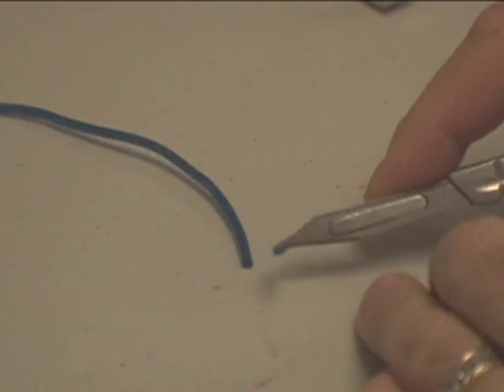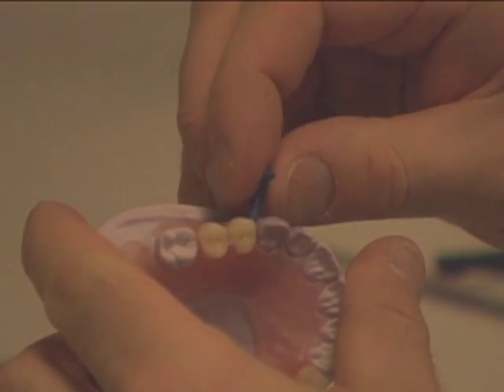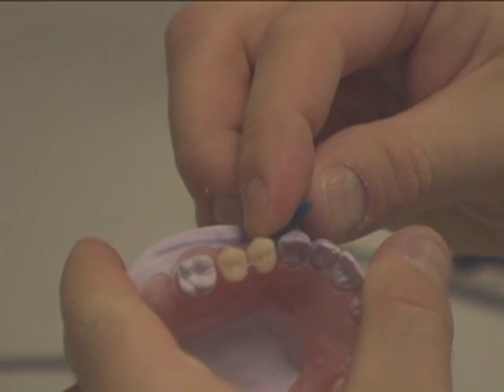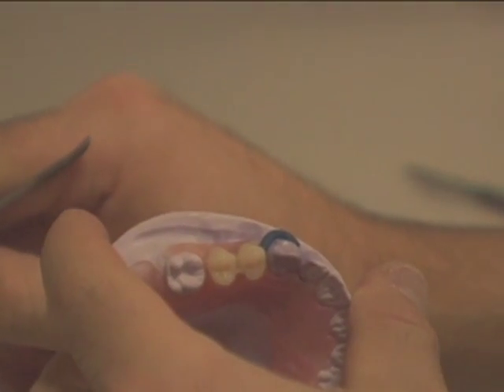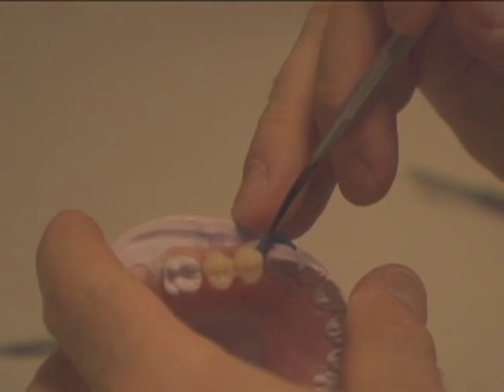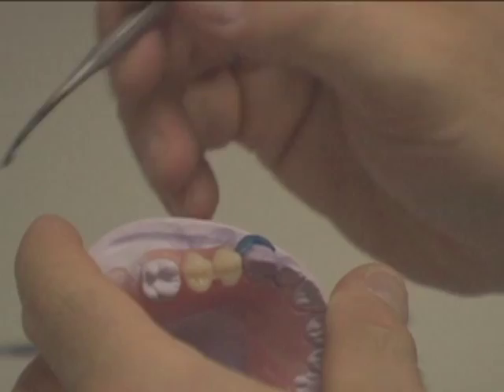Waxing. Create the clasp using 12 gauge sprue wax. Place the wax over the marked area down at the gingival. Using a hot spatula, seal the sprue wax to the model and extend the wax down onto the tissue. This will give the clasp stability.